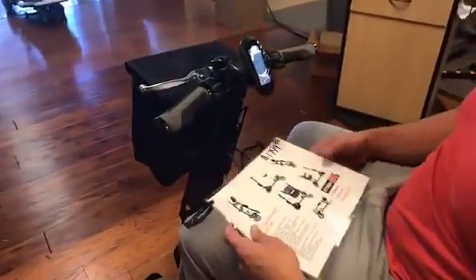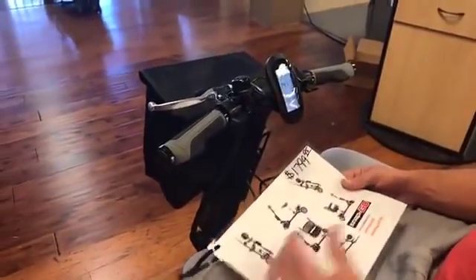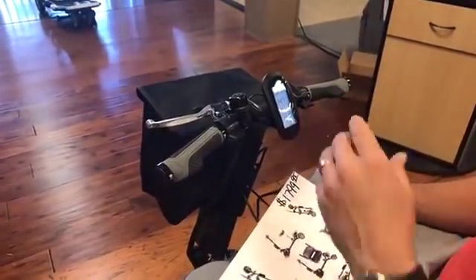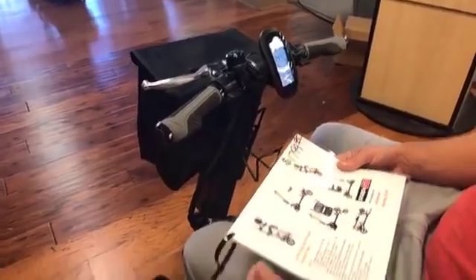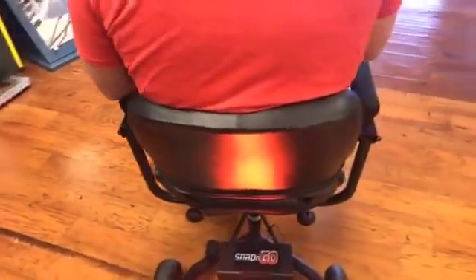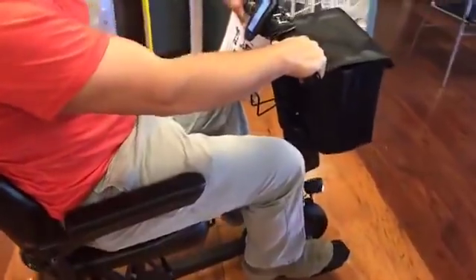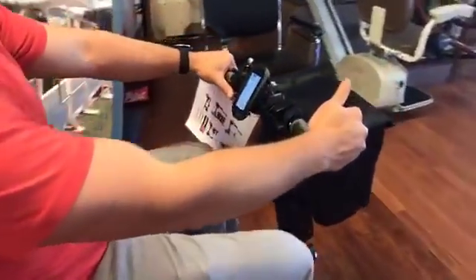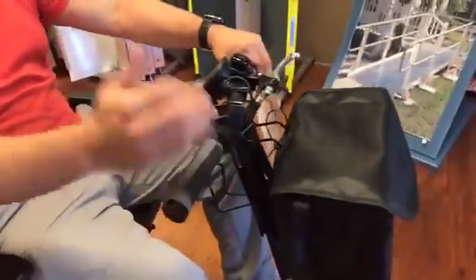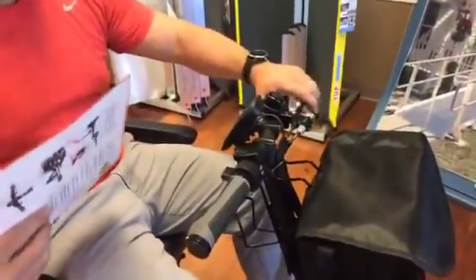I always tell people to be careful when you look at that 15-mile battery range, whether it's Pride or any manufacturer, because a lot of it has to do with the terrain that you're dealing with and how much the individual weighs. This product has a 300-pound weight capacity, and the difference in the handles as far as driving here is you drive forward with this one and you reverse with this one. So a little bit different. It does have a brake to lock it in place.